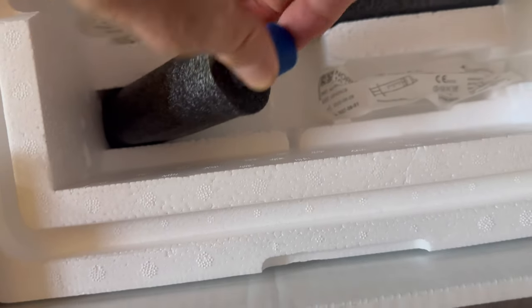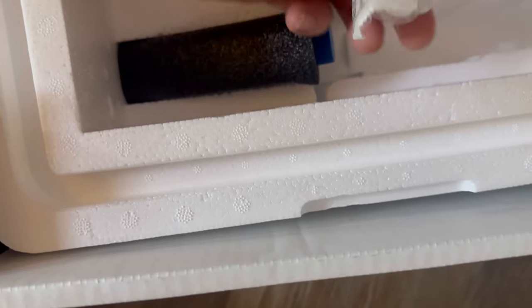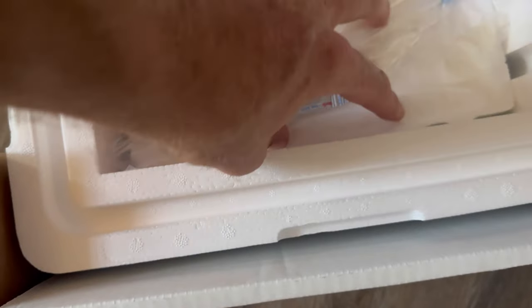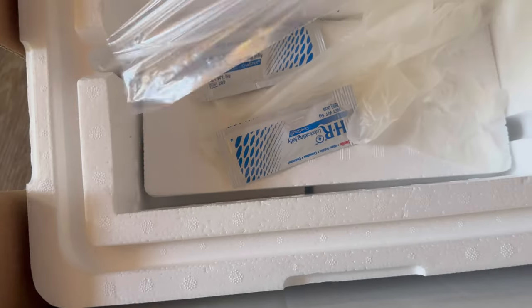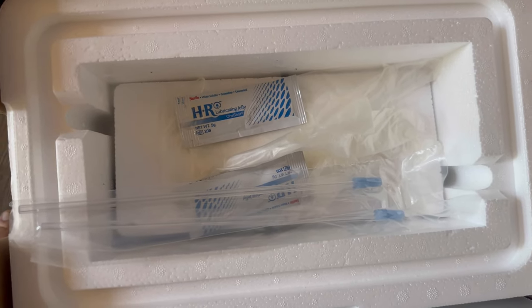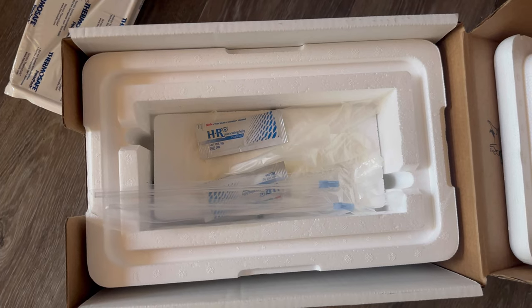This is where you can put the semen. Two of those, looks like two of the valves. This pushes down. And you got these two straws you can send to them, and you got the gloves and the lubricant. So pretty much everything you need right here in this handy little shipping container.